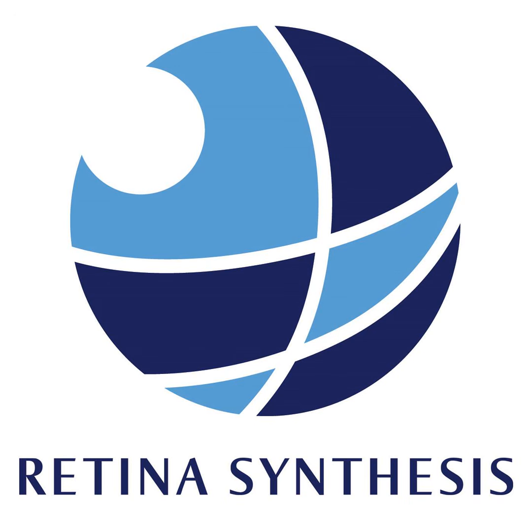In the choroid, you start getting light streaking into the choroid, and on an individual B-scan, it kind of looks like a barcode. But on en face imaging, you can see this entire area where the drusen was located becoming brighter if you focus on the light under the choroid, and that's what's wonderful about en face imaging. You can segment just that region under the retinal pigment epithelium, and those individual drusen start lighting up. They look like stars in the sky, and they're so easy to observe, and they're so easy to grade, and that's the earliest manifestation of a drusen going to geographic atrophy.